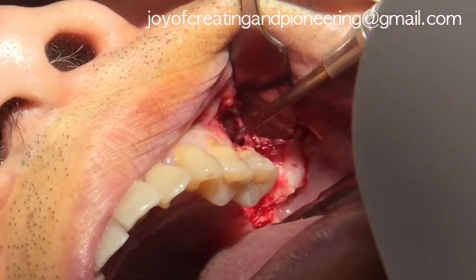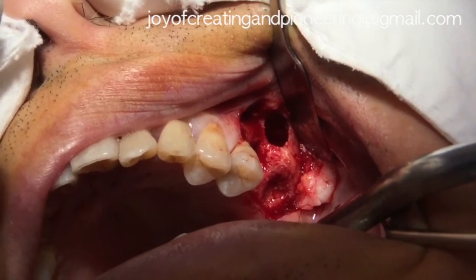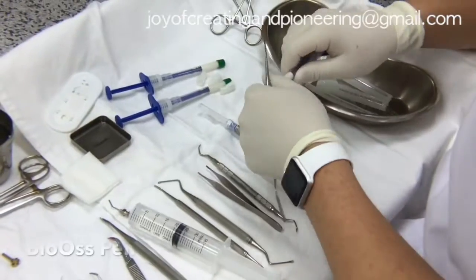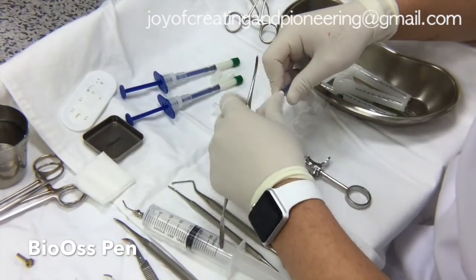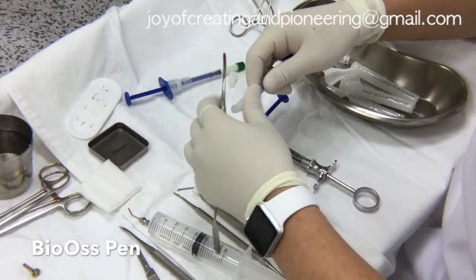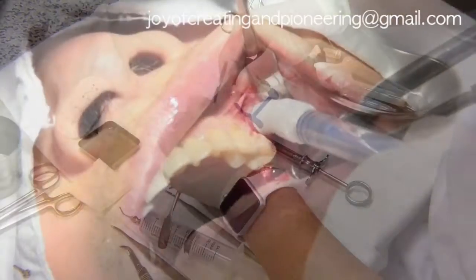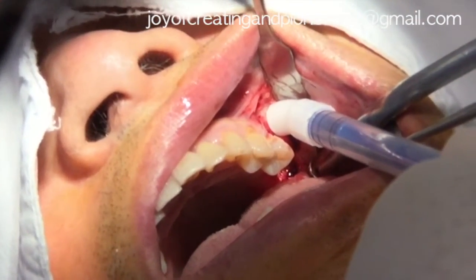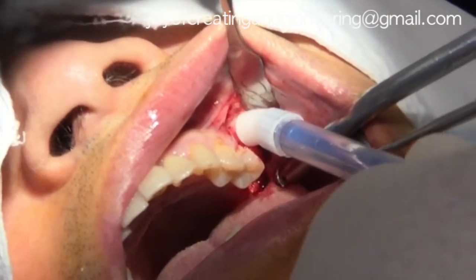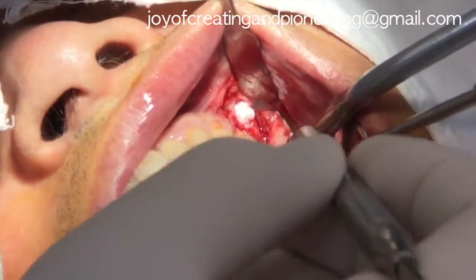Using the Valsalva method, the absence of perforation was confirmed visually. The bone graft material was Bio-Oss, sourced from Geistlich company, and 1.5 cc was prepared. The graft was carefully inserted into the sinus cavity and great caution was applied not to accidentally perforate the membrane.